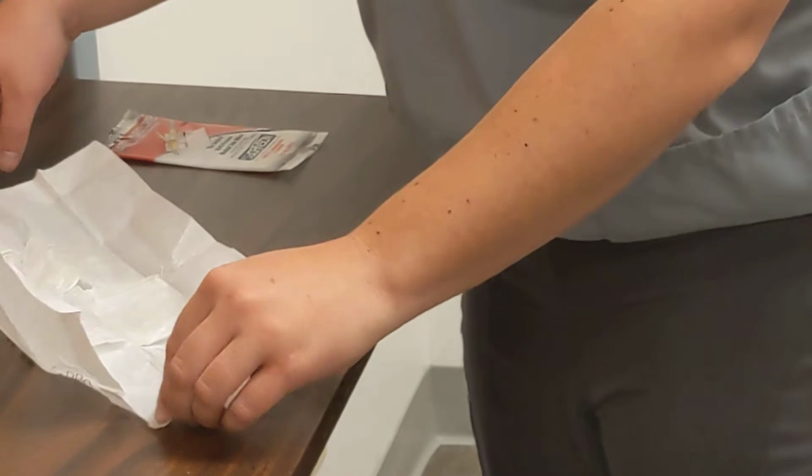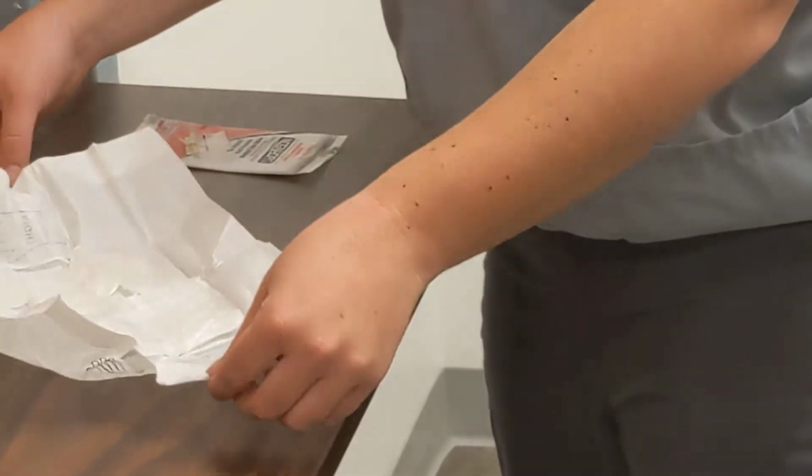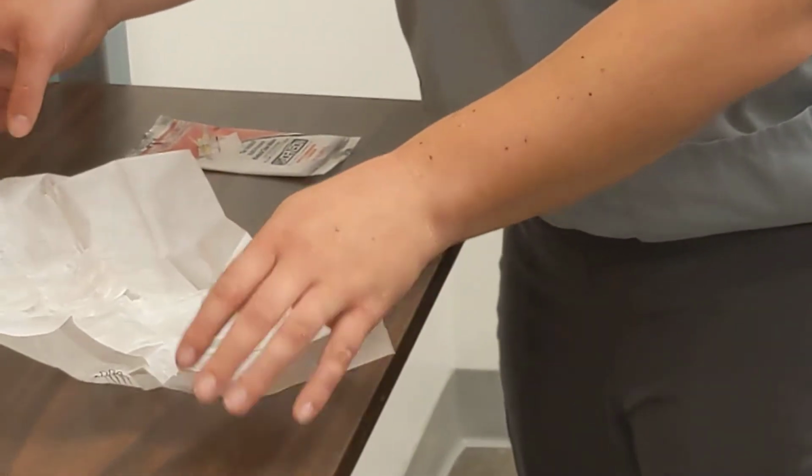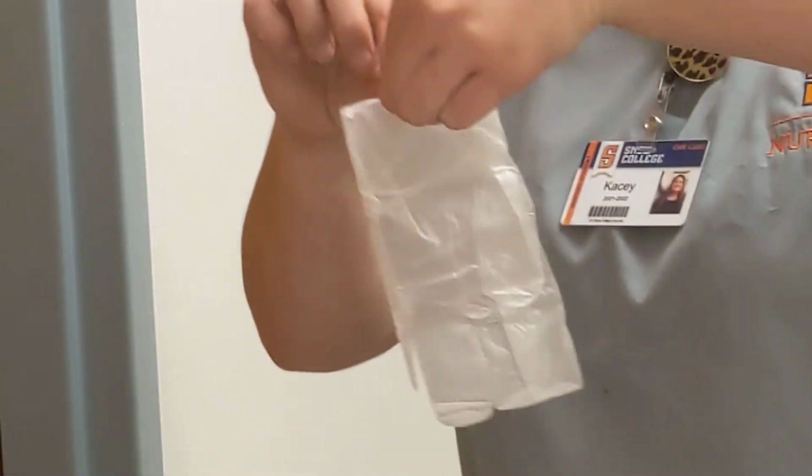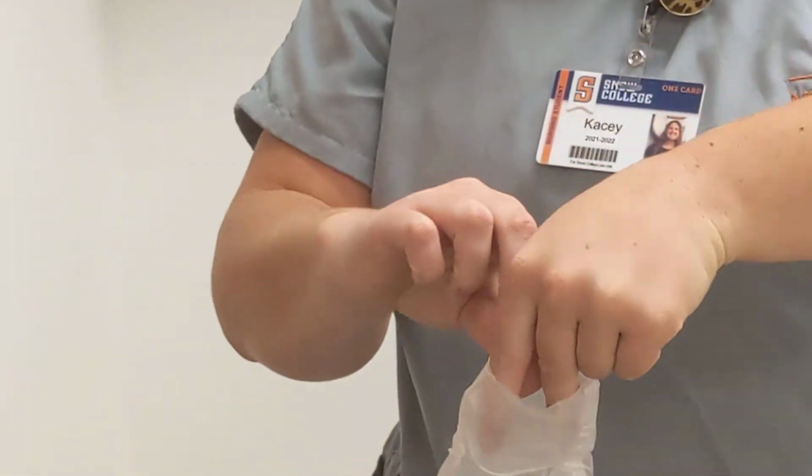I'm going to try to make it stick. Okay, awesome. All right, so first we're going to put our left glove on. And as you can see, we're not going to be touching anywhere on the outside.